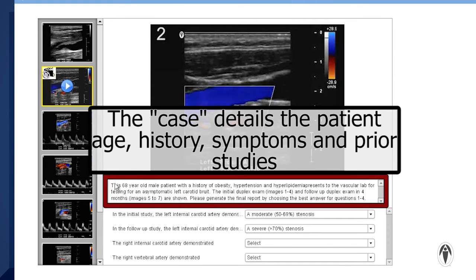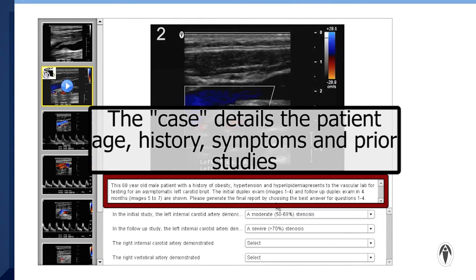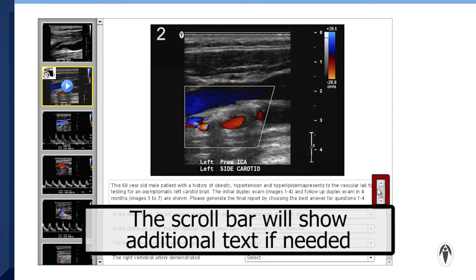The case details the patient age, history, symptoms, and prior studies. The scroll bar will show additional text if needed.